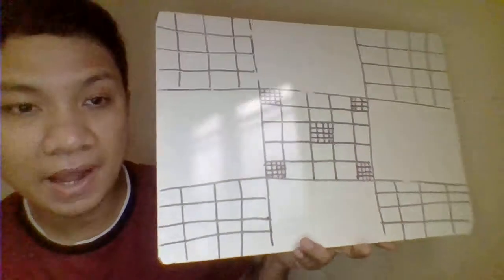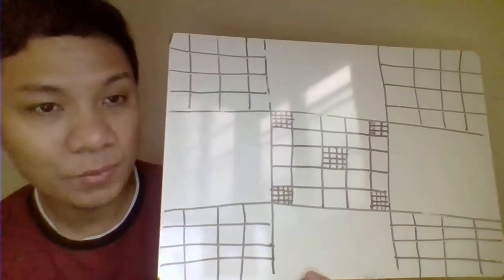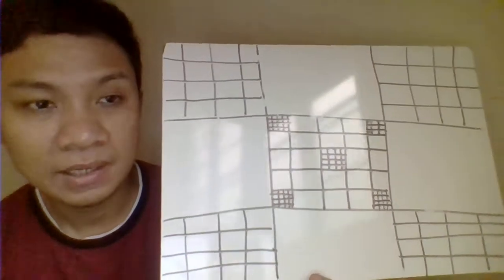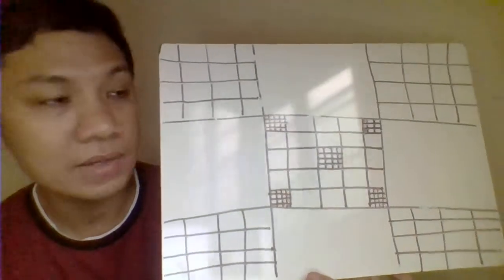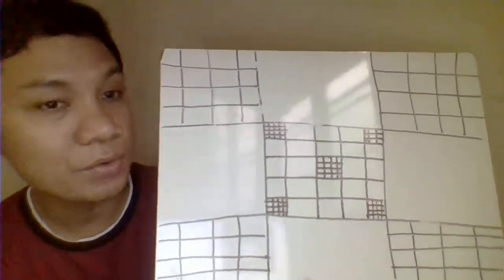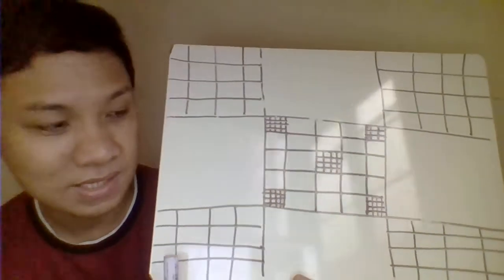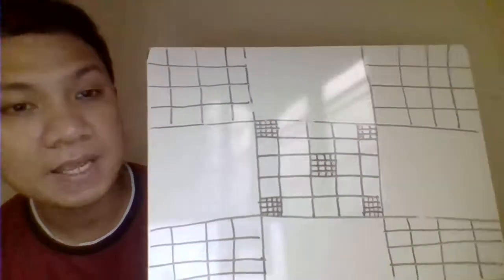Again, in our one ruled area, there are 9 squares, and we have 4 corner squares. That's where you perform your WBC count. Each of your large corner squares is divided into 16 smaller squares: 1, 2, 3, 4 by 1, 2, 3, 4, that's 4 by 4, 16 smaller squares.